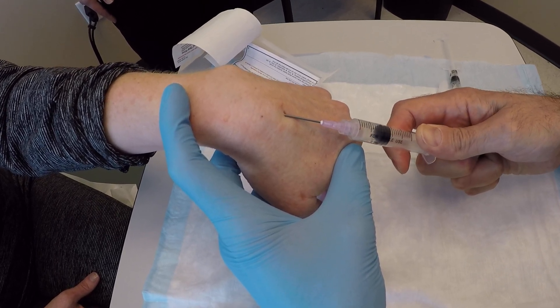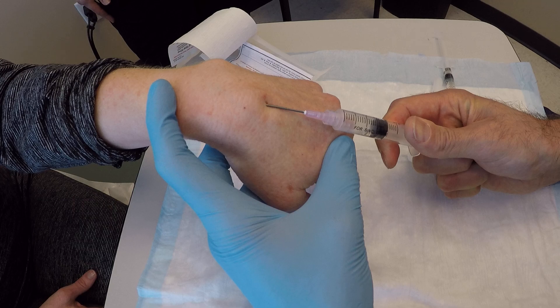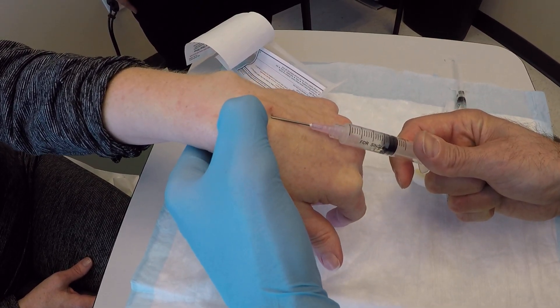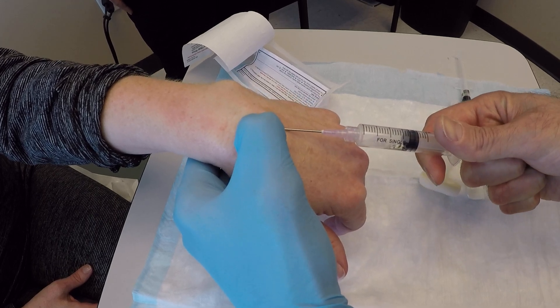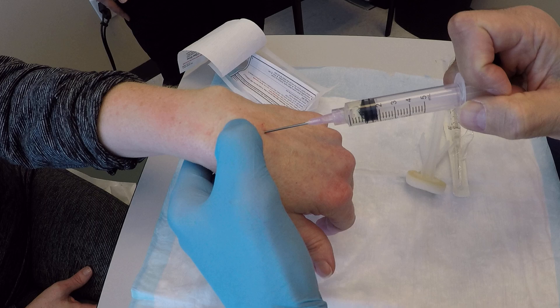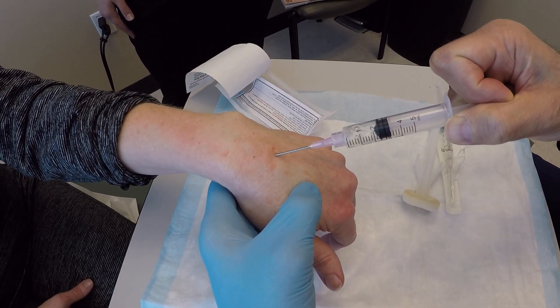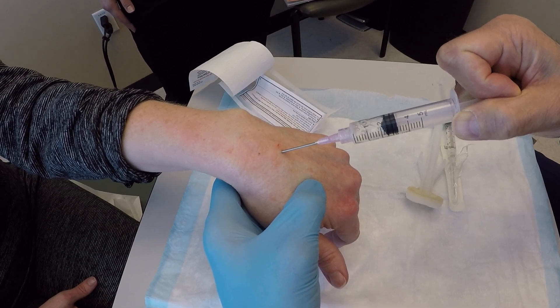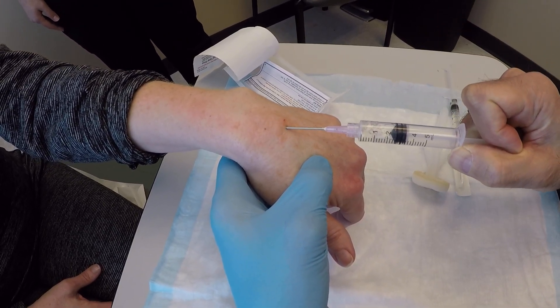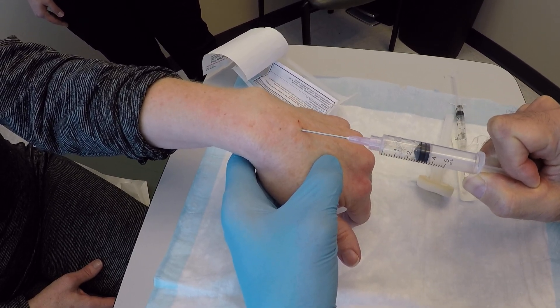I'm going to look at the jelly coming out of that, and it's decompressed. So do you feel me going into your wrist there at all? A little sore? Yeah, I'm just trying to see if there's any other spaces in there. I've got to decompress. I think that's it.